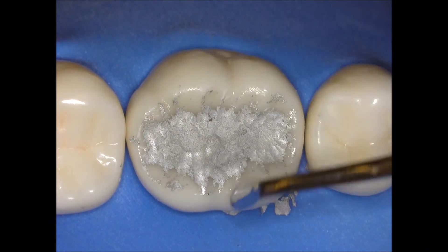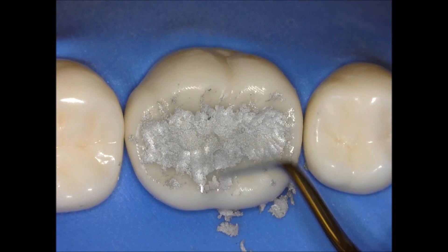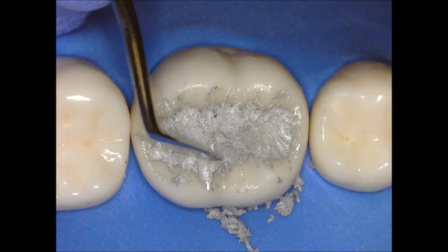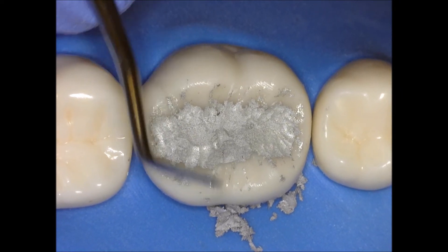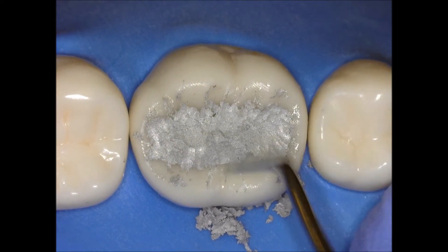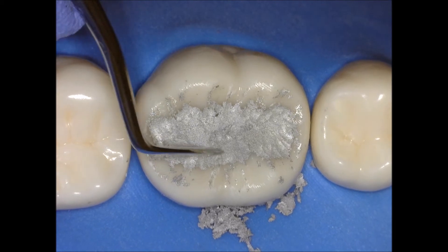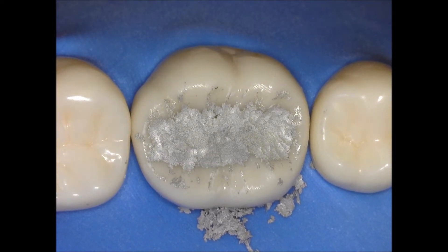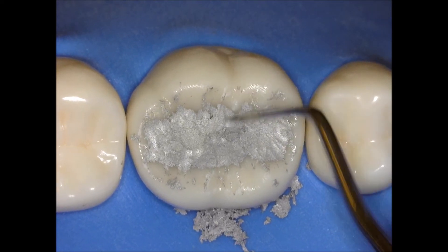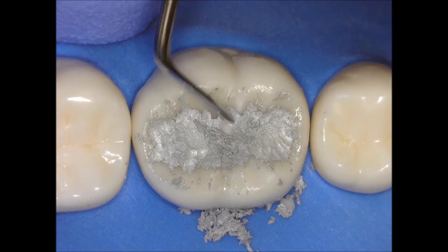Now I'm going with the Hollenbeck and I just want to make some landmarks. The best landmarks you can do are your buccal and lingual grooves — you never do the central groove, because the central groove will come out when you're carving the triangular ridges. What I'm doing here is just removing a little bit of excess, creating the lingual groove and then moving to the buccal groove. Remember, this is the first mandibular molar so it has two buccal grooves: the mesial buccal groove and the distal buccal groove.